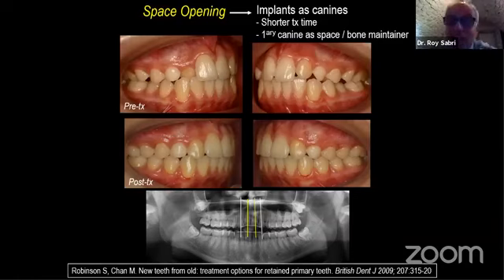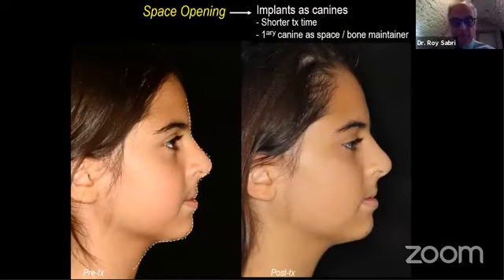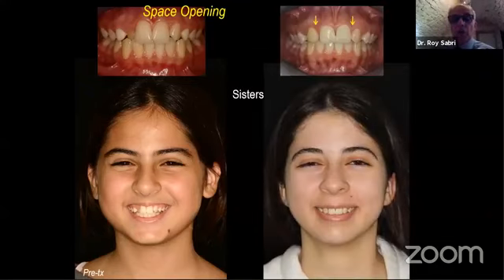But the second major advantage is that this primary canine is going to act as a space maintainer and as a bone maintainer, and the patient will not rely on a removable retainer to replace the missing teeth. Okay, so the profile almost stayed the same because we didn't move teeth anywhere. And here she is waiting for end of growth.